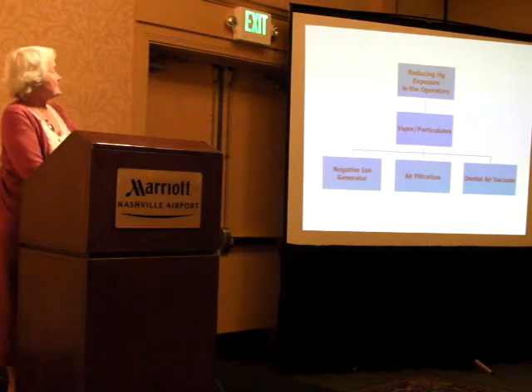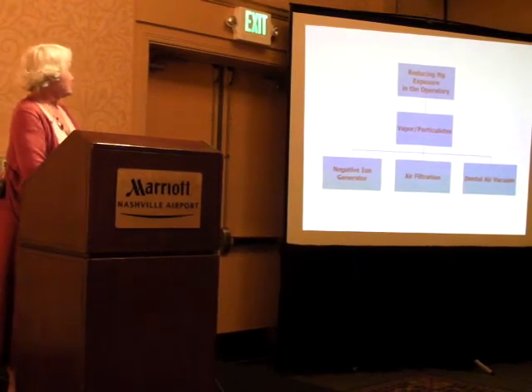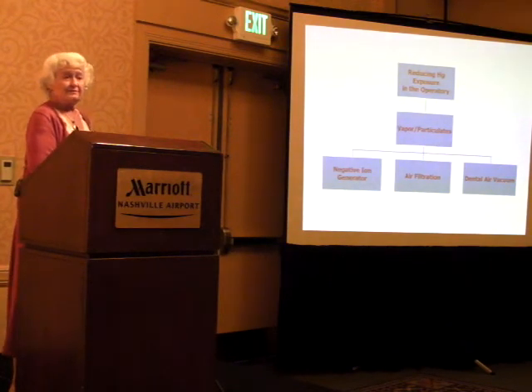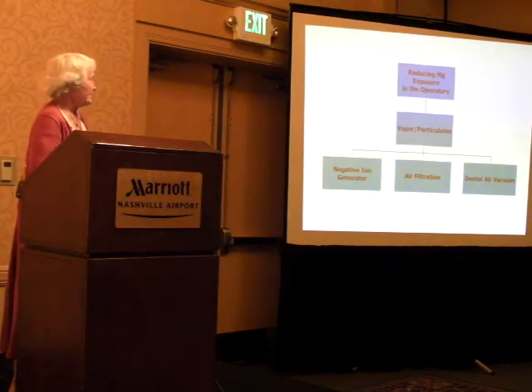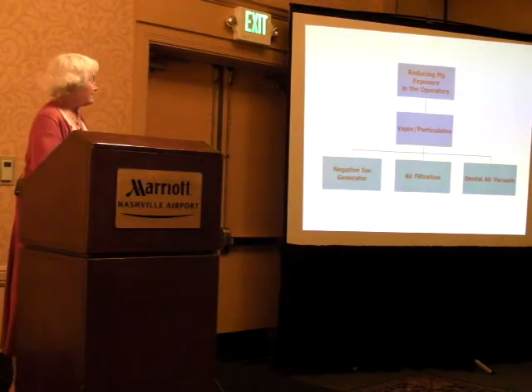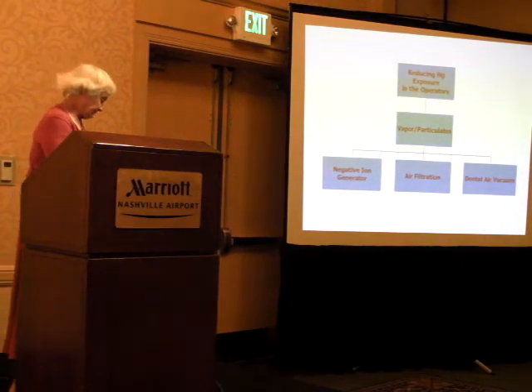So we need to reduce the mercury vapor exposure in the operatory. As I mentioned prior, vapor and particulates are the prime problems. The vapor's immediate, it's just immediately absorbed. The particulates, because of their size, are absorbed through the skin, and then they become vapor. So they're one part and parcel of the same thing. We do this with a dental air vac. You've already seen that one, the big albatross, air filtration systems, and the negative ion generator.